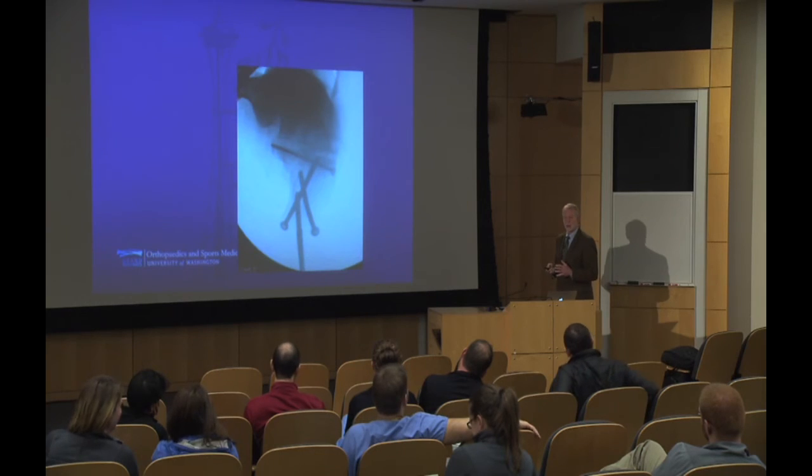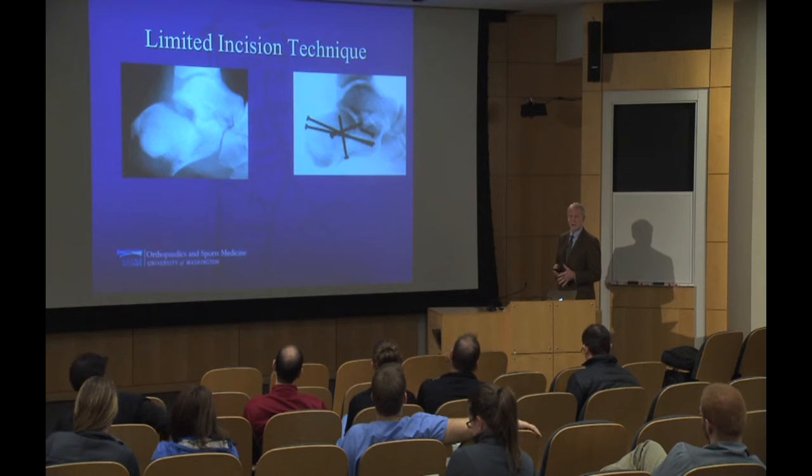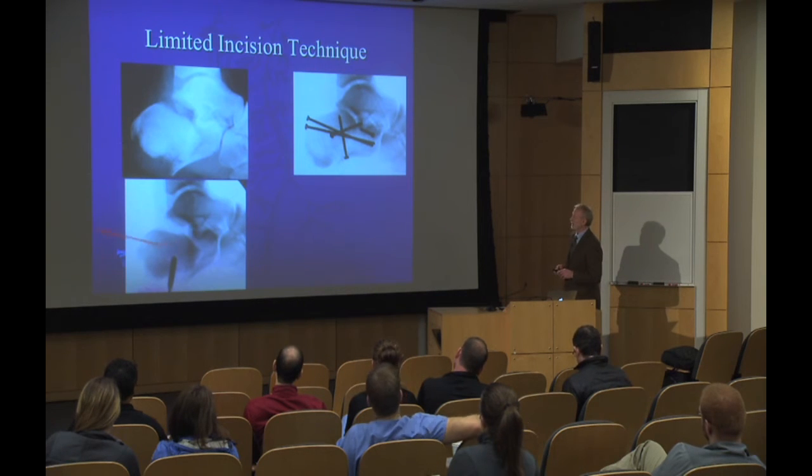So that was my index telling me that this technique had opportunity, that this guy could be full weight bearing in 13 days post-op without any destruction of his injury. And so I started doing a little bit more of them after that. So this is the technique. It can be applied to a variety of different constructs.